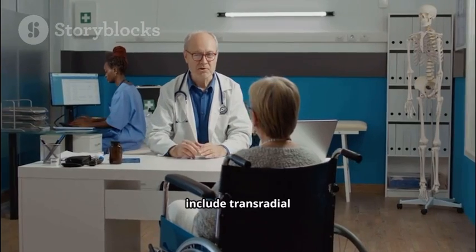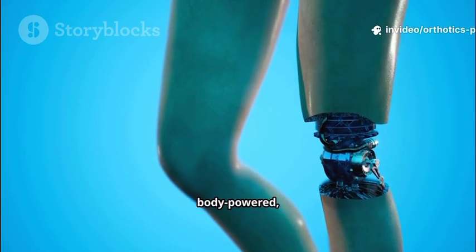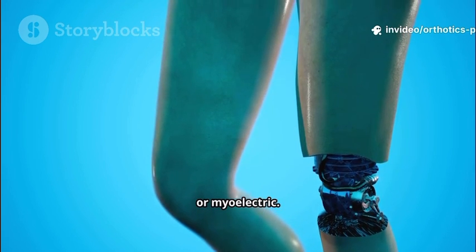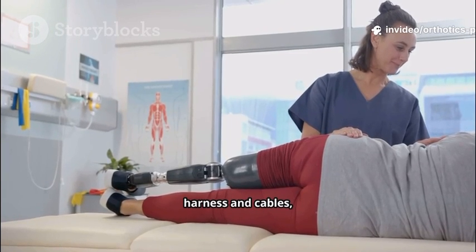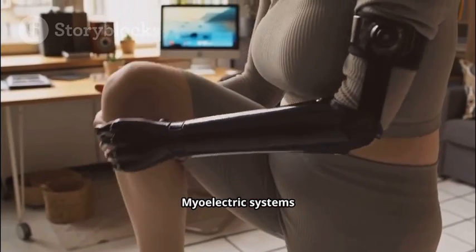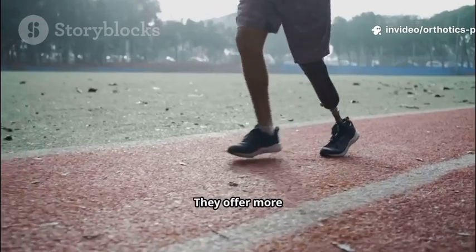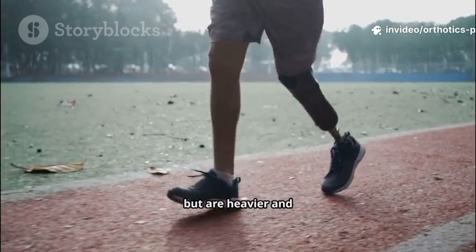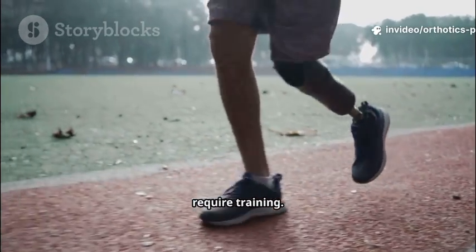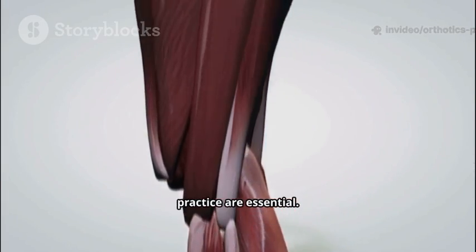Upper limb levels include transradial and transhumeral. Prostheses can be passive, body-powered, or myoelectric. Body-powered uses harness and cables, offering durability and feedback. Myoelectric systems detect muscle signals to drive motors for hand and wrist. They offer more natural control and strong grip, but are heavier and require training. PTs play a key role in teaching control. Patience and practice are essential.